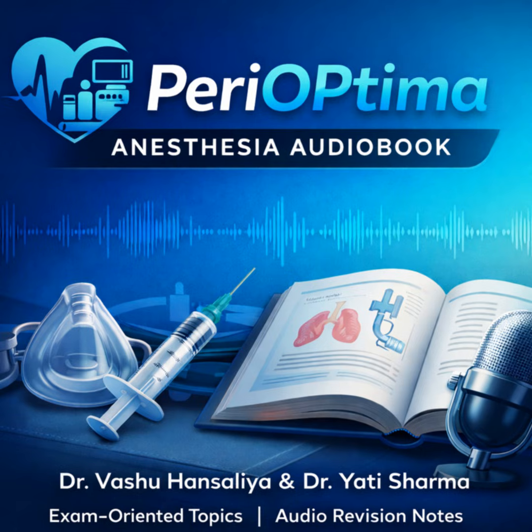The need to overcome those grade 3 and 4 views is what really pushed the field into its next era, video laryngoscopy. Let's really dig into this technology. VL is the direct technological solution to the anatomical problem of the direct line of sight. Okay, so define it for us. What's the basic principle in simple terms?